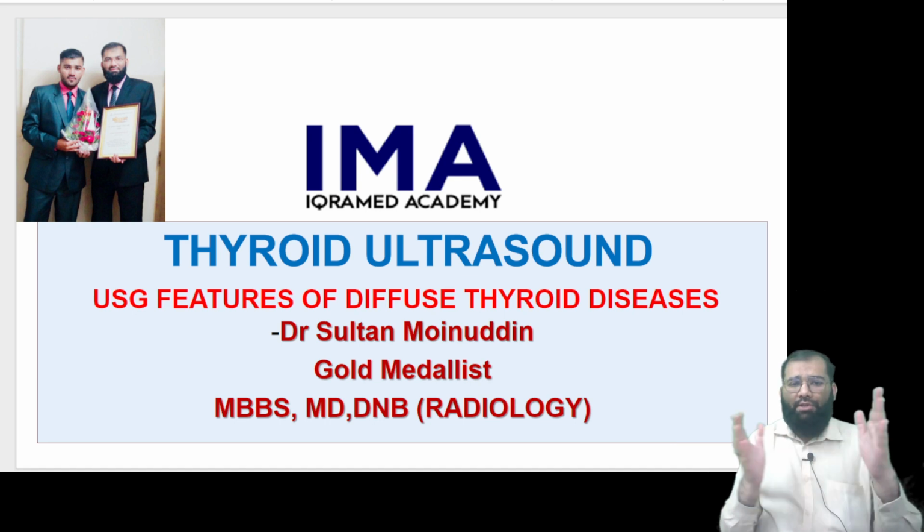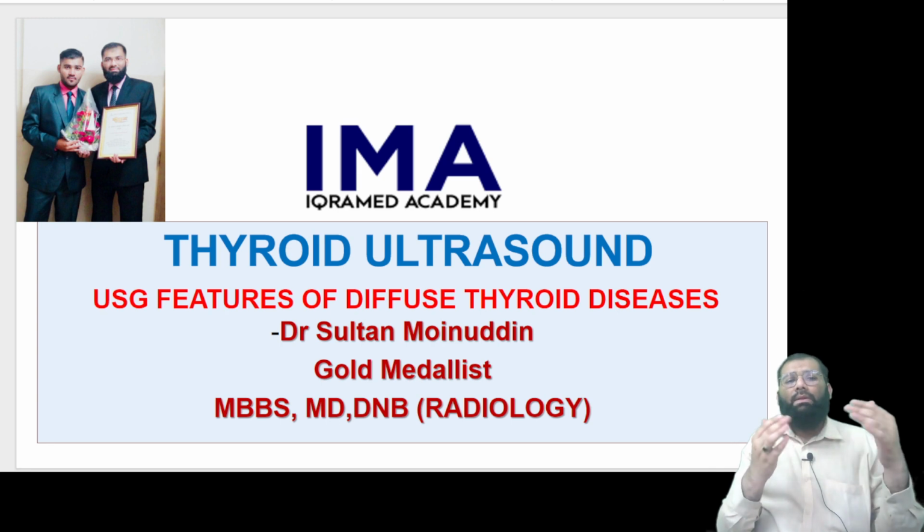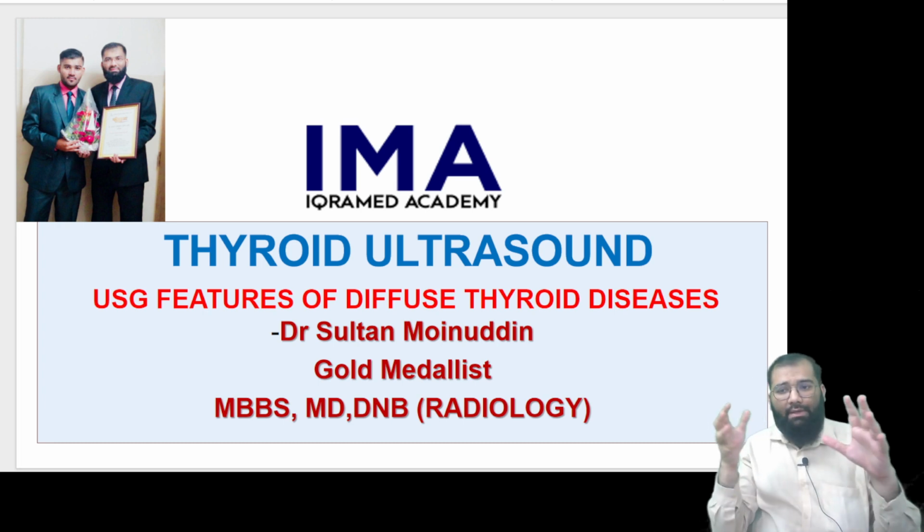In today's session, we are here to discuss a special topic: ultrasound features of diffuse thyroid diseases. In my previous session, I discussed one diffuse thyroid disease.